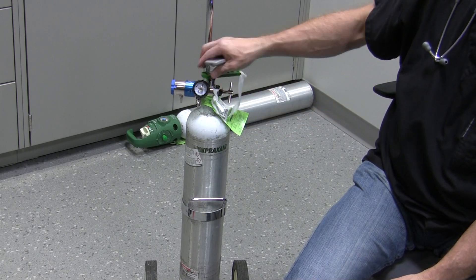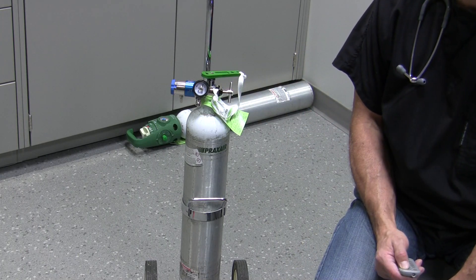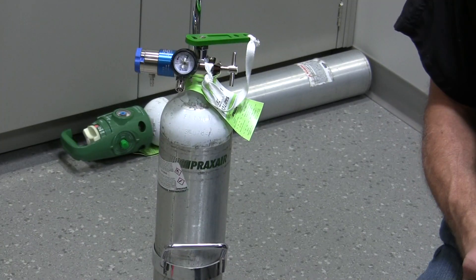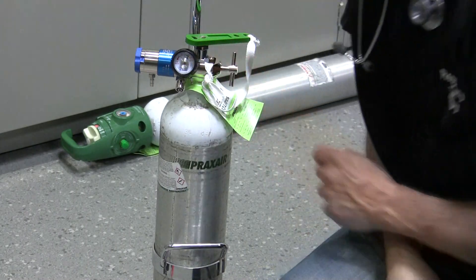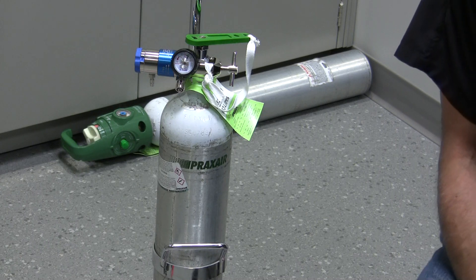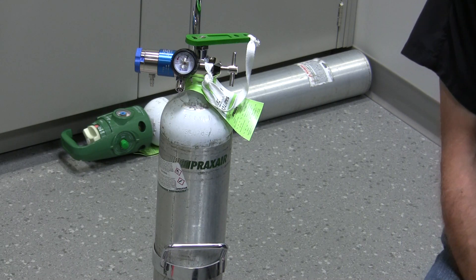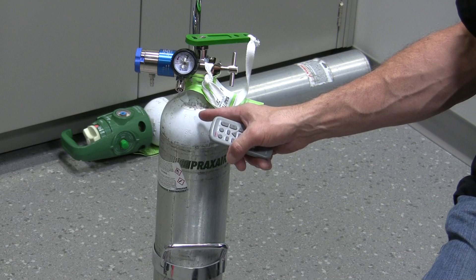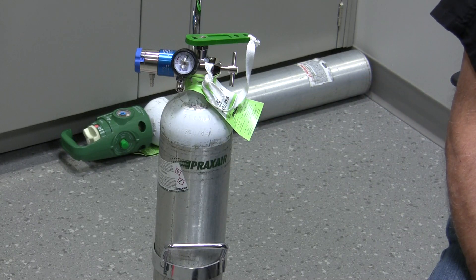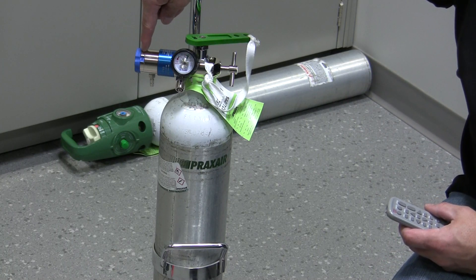Secure it in place with the thumb screw here. Once you've got it securely in place, you can turn the cylinder on. You'll see the pressure in your cylinder affect the regulator, and the regulator pressure goes up and displays whatever the pressure is inside the tank. This tank is at full — just over 2,000 psi. This full cylinder will last a certain amount of time depending on the flow rate being delivered to the patient.